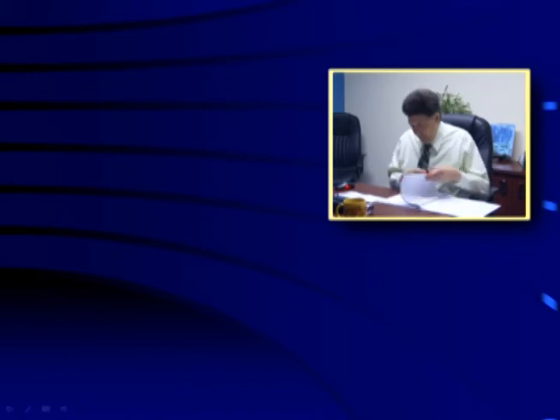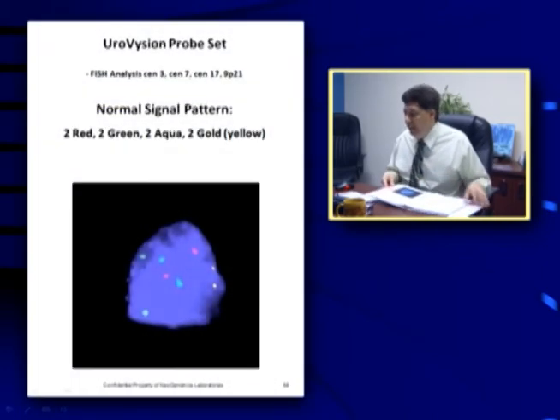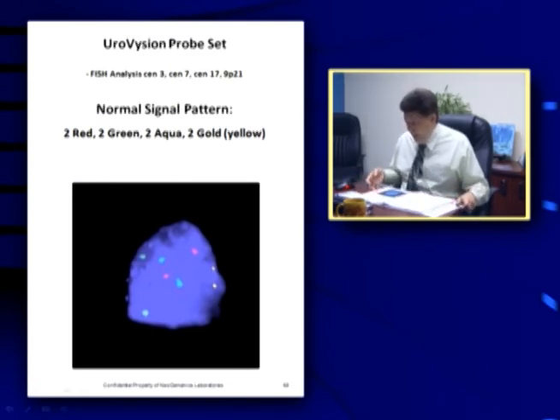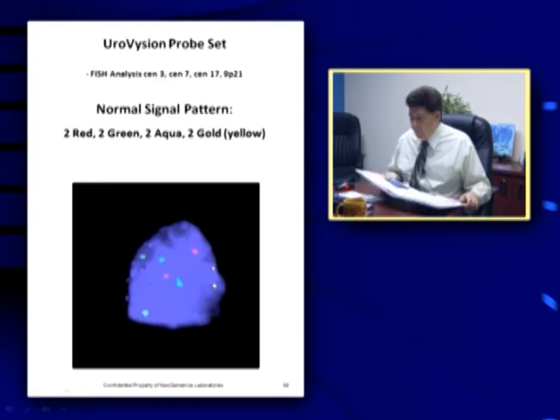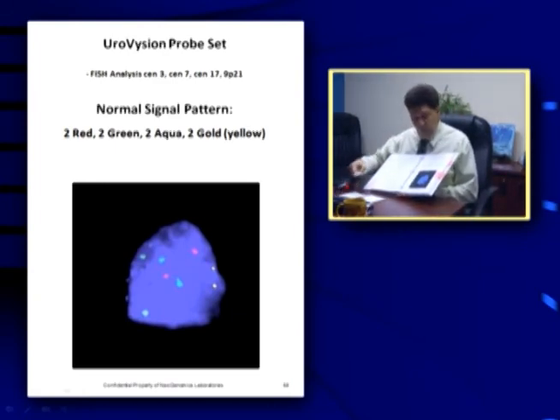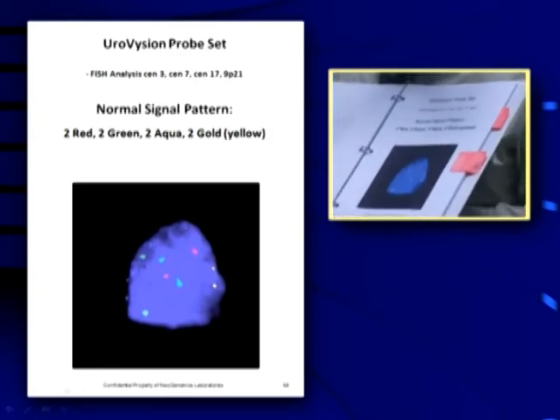All right, if you turn to page 58 in your tech-only fish manual, let's take a look at a couple of more examples. Now, on page 58, these are not pretty, this one in particular, but if you count it up right away, you can see that there are 8 signals.